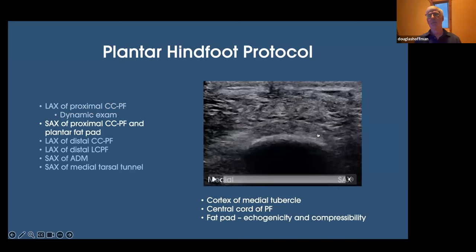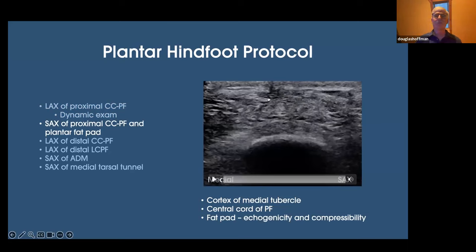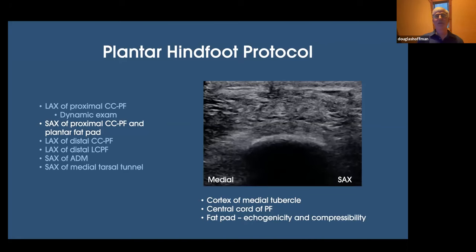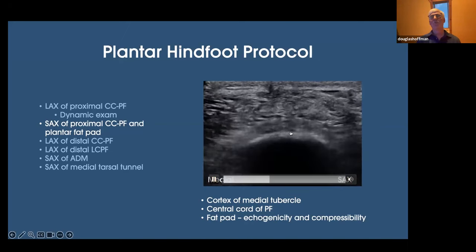This is our short axis image. I use a three-step approach: the cortex looks good, the central cord fibers look good, and then the plantar fat pad. I look for two things in the plantar fat pad: heterogeneity versus homogeneity — we want homogeneity as normal — and I look for fractures or focal areas of hypoechogenicity. I also compress the fat pad and like to see it compressed less than 50%. In this case, it clearly compresses less than 50%.